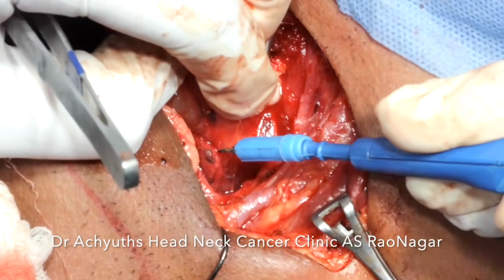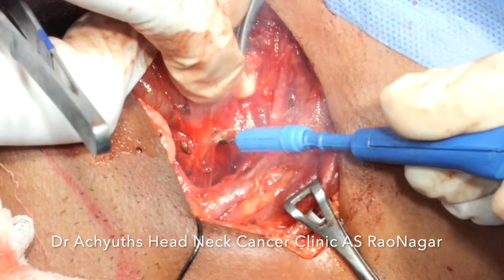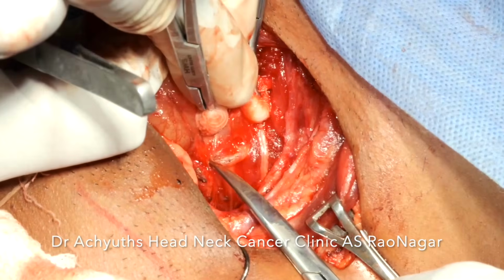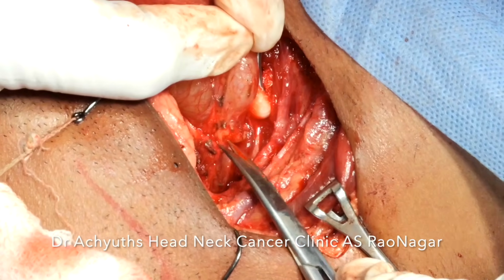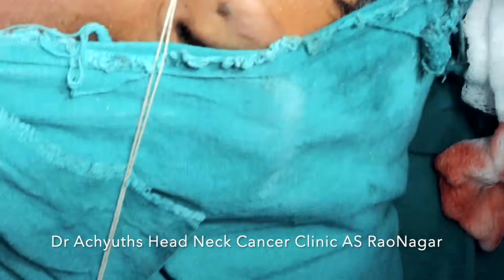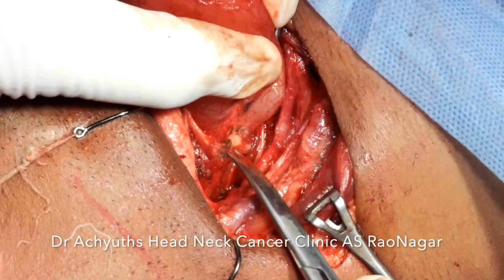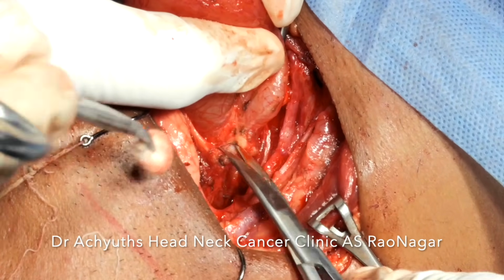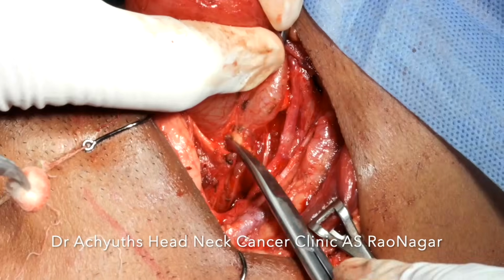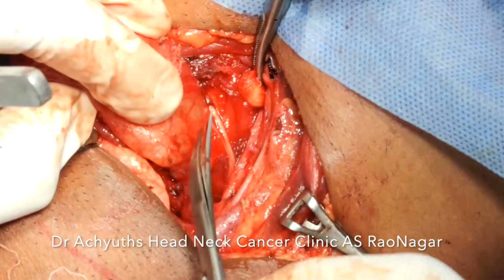Here again, this is the lateral border of the thyroid cartilage, from where we are trying to divide the pharyngeal constrictor attachments, because the cyst is densely adherent here. We know that the main vascular and neural structures are preserved, so the other things we are gradually dissecting out.